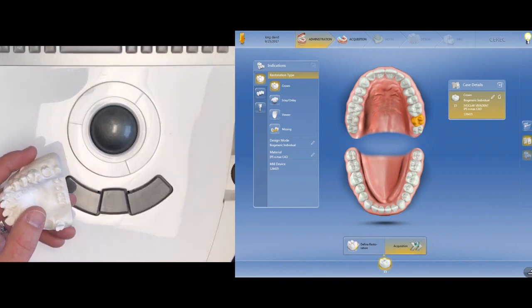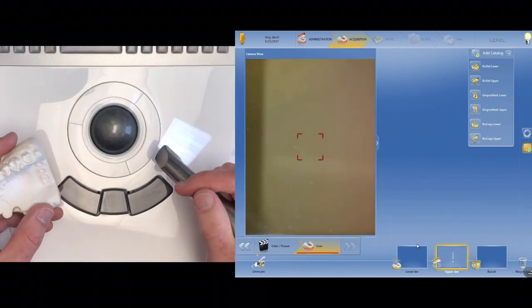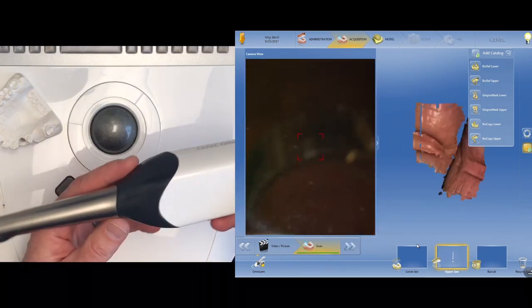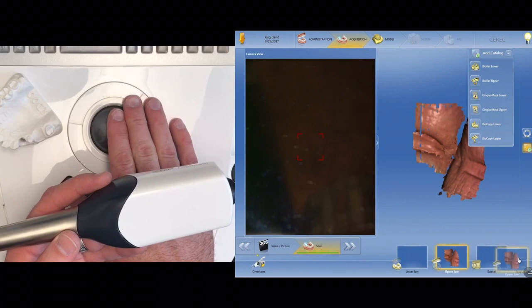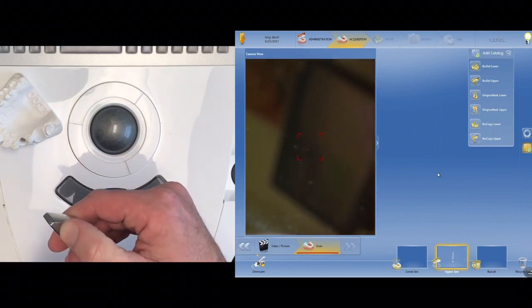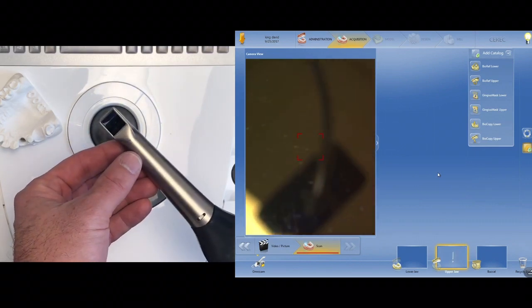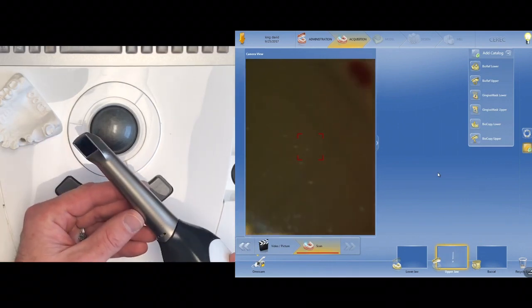Now, it should be fairly clear to you already that the CEREC machine itself is a pretty expensive little gadget, so you want to be very cautious with it. I know that the camera itself is several thousand dollars. I was told once by a lab repair technician that the whole camera was about $15,000 to replace. So you want to be very cautious with it. Don't drop it. Be careful with it. These sleeves here are more than $1,000 to replace. As you may be able to see here, as the light's flashing, there's some scratches on that lens right there. So be cautious not only when you're cleaning it, but when you're imaging, you don't want to drag the lens across the surface of the tooth.